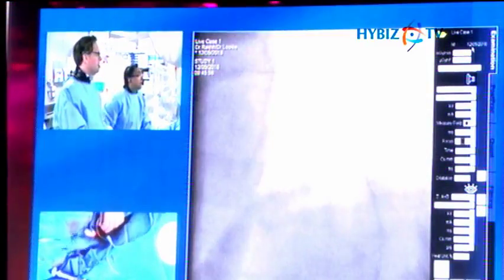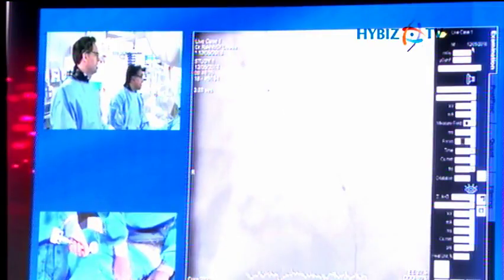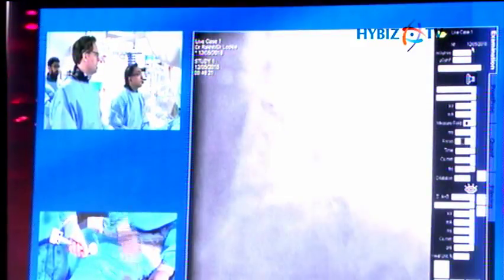I'm going to go up there. I'm just going to do an acquisition. Sorry, I'll answer your question in a moment. I'm just going up slowly. In a minute, you'll see the balloon going up, and then you'll see the sheath suddenly come away. There. You see what I mean about the balloon coming proximal, so you really want to make sure that you don't traumatize the vessel proximally.